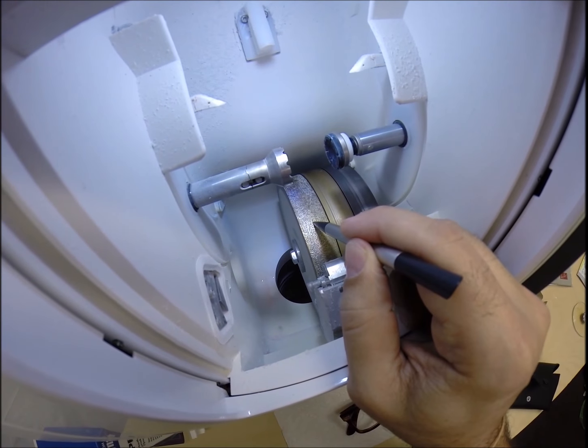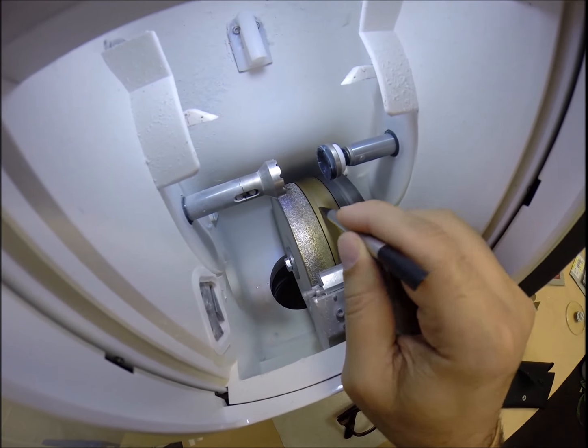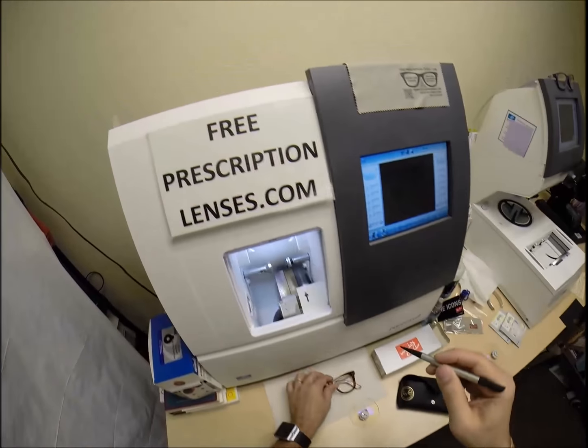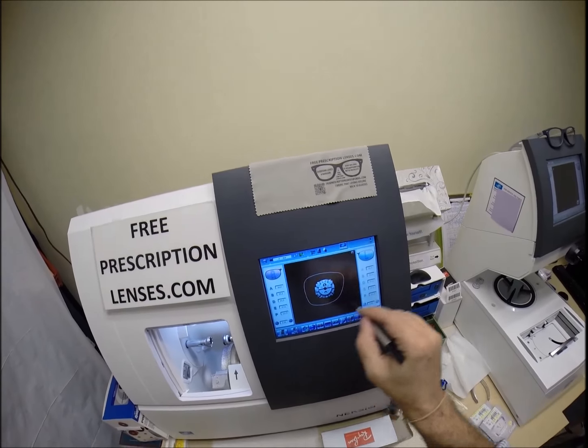It's a diamond crusted wheel that's going to grind your lens material down till it's the final size. This wheel in the center of that channel, that little valley, that's what's going to put the V-shaped bevel onto the lens so it stays inside the bevel of the frame. I'm going to wake up the computer. That is the shape of the lens we are cutting.